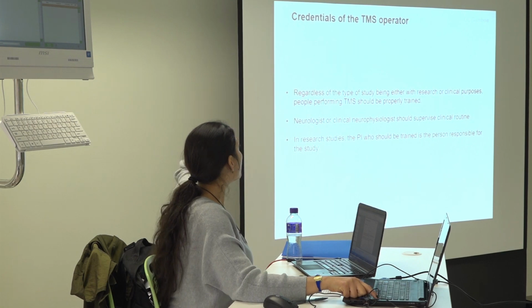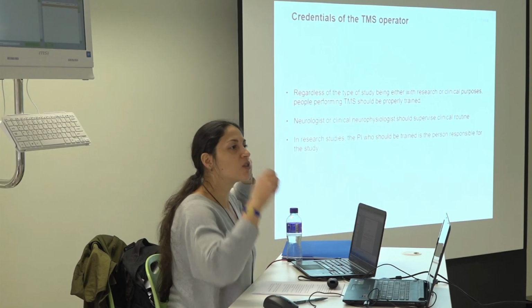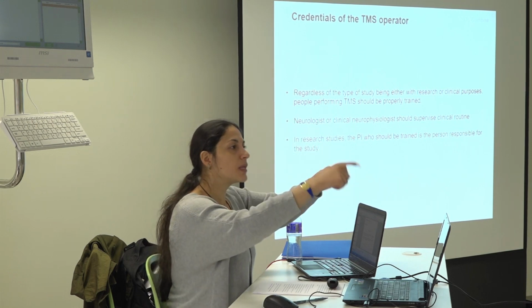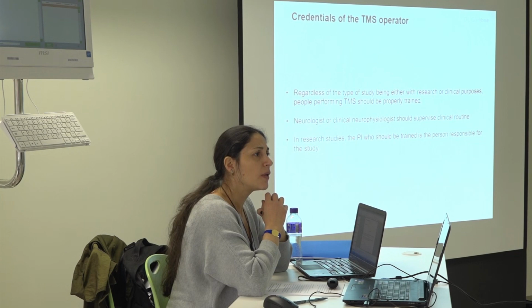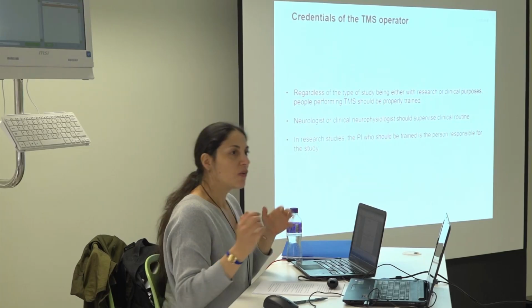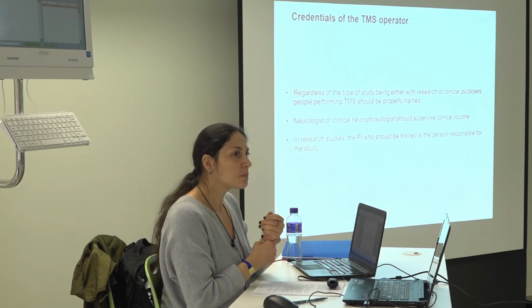Credentials of the TMS operator. So who should do TMS? I have seen some people doing TMS who have no idea about TMS. Someone has said, probably, you put the coil like this and you just do it. And I find that really irresponsible because it's serious stuff. You could train, it's no rocket science. You don't need to do a master's in it, but you need to have some knowledge about it.